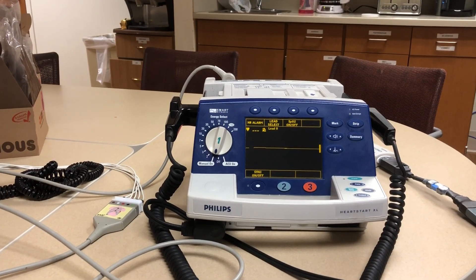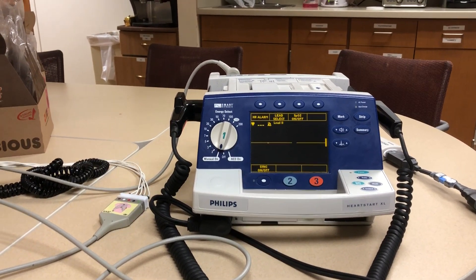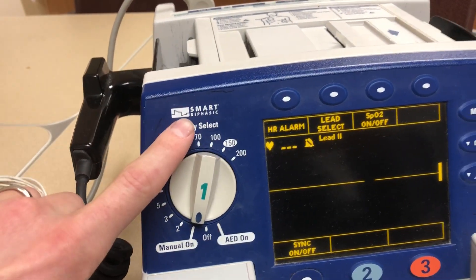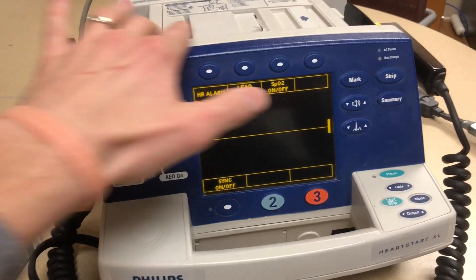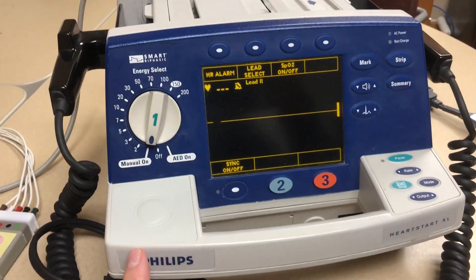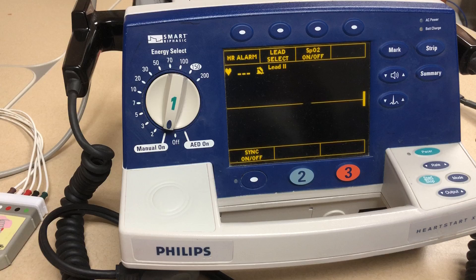All right guys, got a quick little in-service on the monitors. So our biphasic — the ones we're all used to. We know it's biphasic because it says biphasic. The HeartStart Philips monitors.